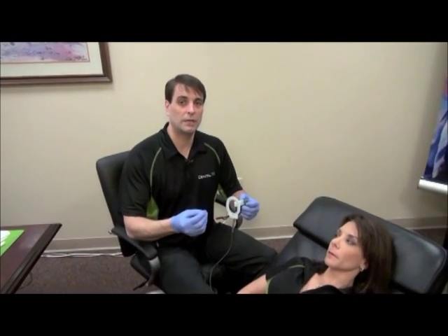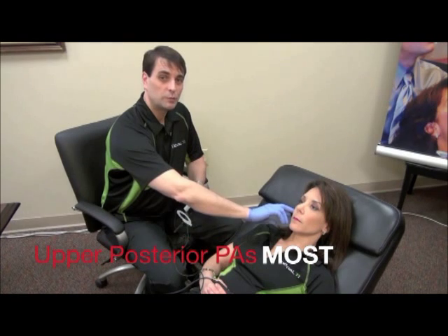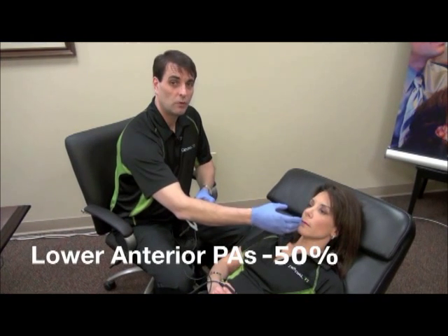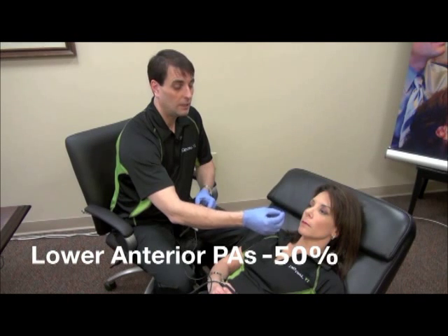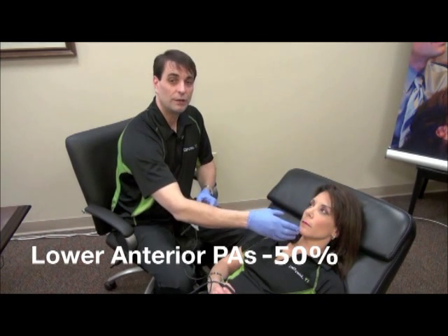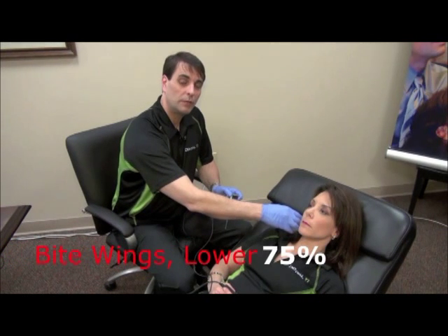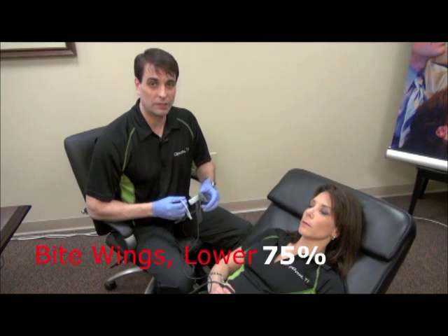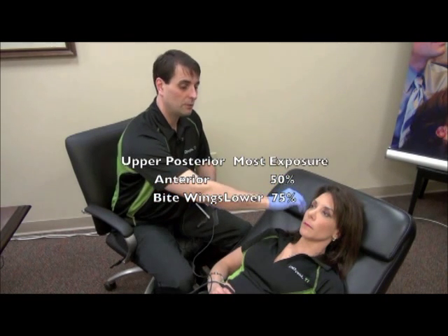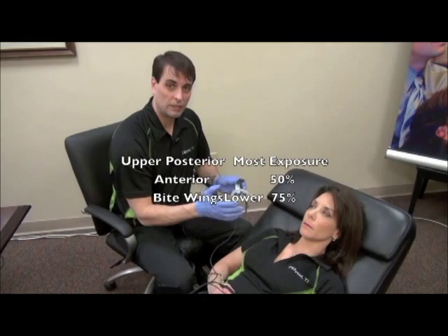When you're taking x-rays, varying your exposures is really important. Upper posterior PAs require the most amount of exposure because we have the most bone density in this region of the mouth. Lower anteriors and anterior PAs in general require the least amount of exposure. Once we get the upper posterior PA value, we know the anterior PA value is about 50% of that exposure time. Bite wings and lower posterior PAs fall in the middle — so we're working with three different exposure levels: upper posterior PA being the most, anterior PAs being 50% of that, and bite wings and lower posterior PAs falling in the middle of those values.